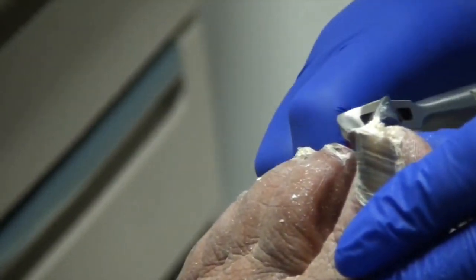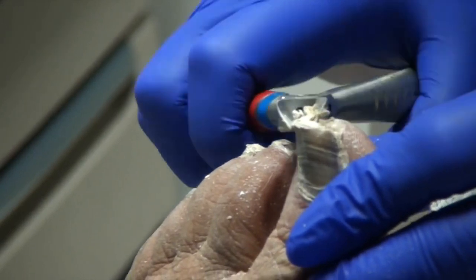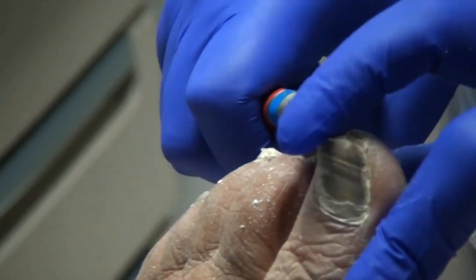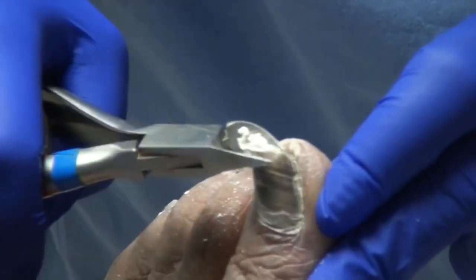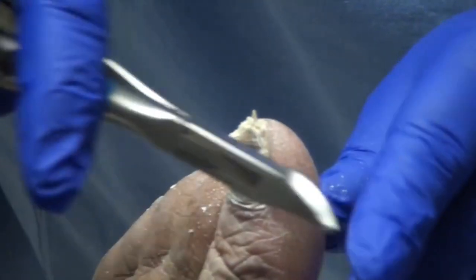Isn't that amazing? And because the nail is dead, it doesn't hurt. So again, we're just following the shape of the nail, using just the tips. And then right before you snap, you cover it.